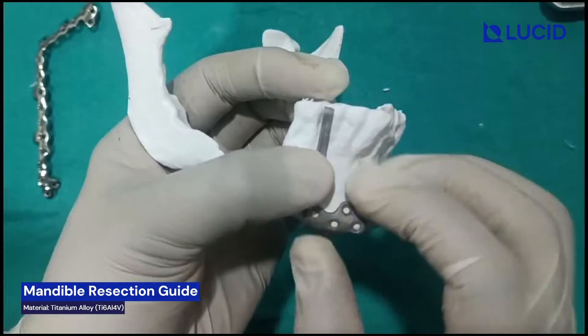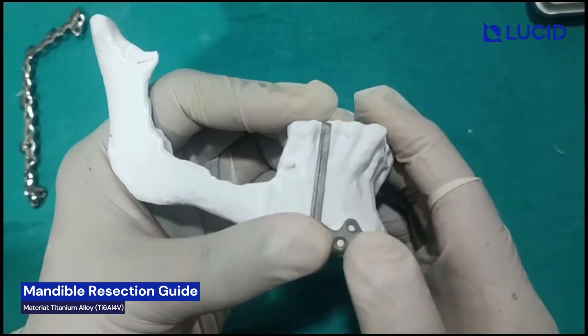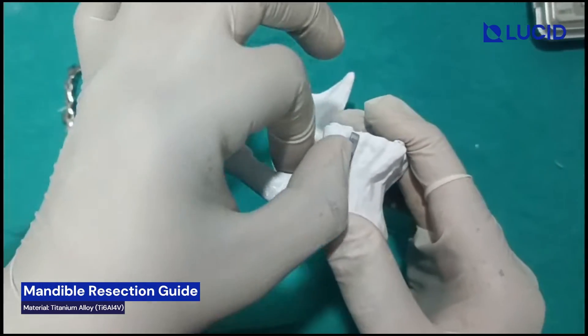Here you have to use 2mm diameter screws, monocortical screws of 6mm length. You can use any two screws to fix this guide. When this is fixed, just do the osteotomy from this side.